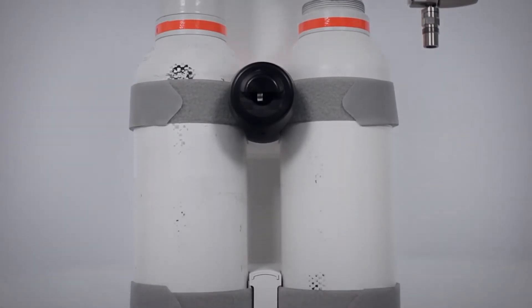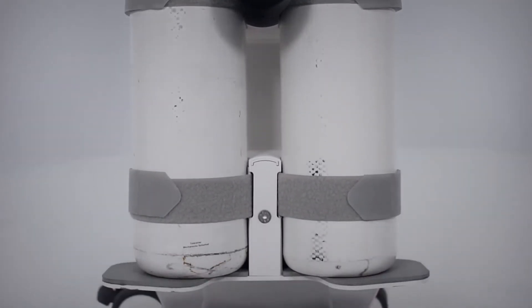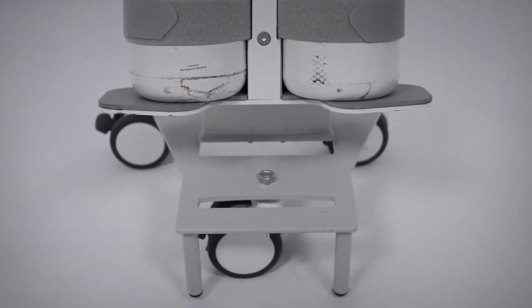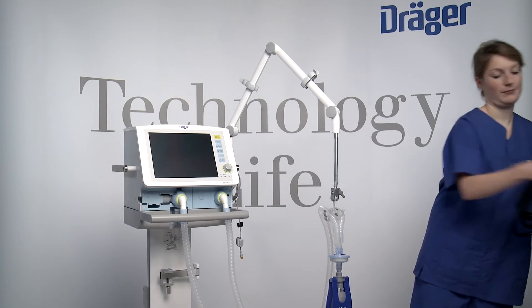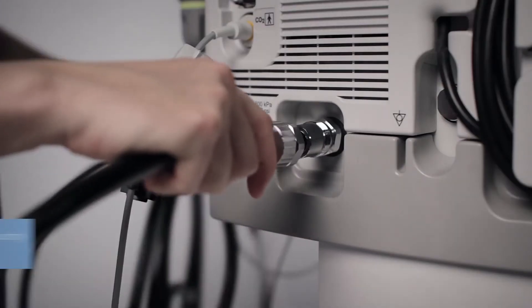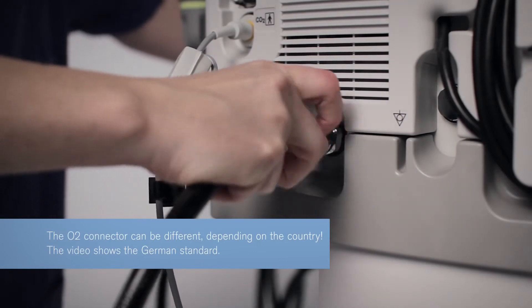For supplying from compressed gas cylinders, Savina 300 can be equipped with a transport supply unit or a cylinder holder. For O2 supply from a central gas supply system, connect the O2 compressed gas hose with the O2 connection of Savina 300.